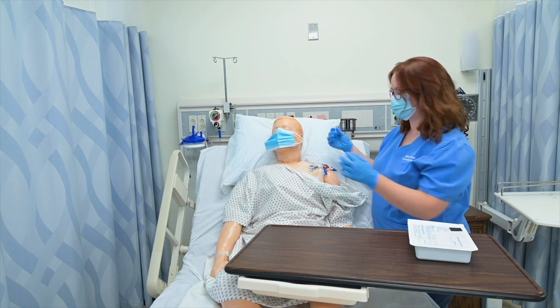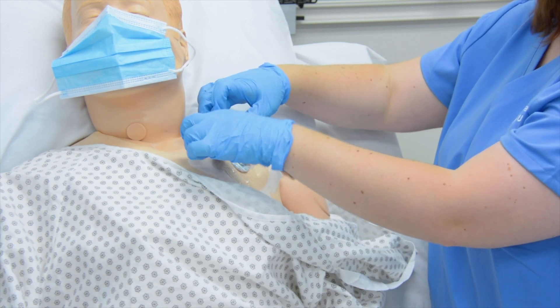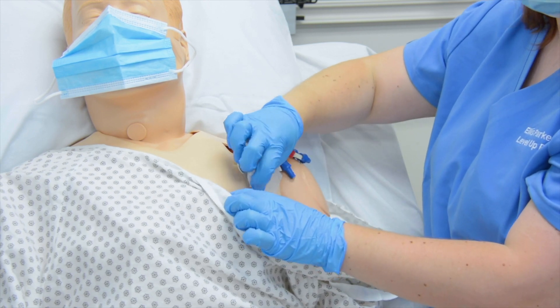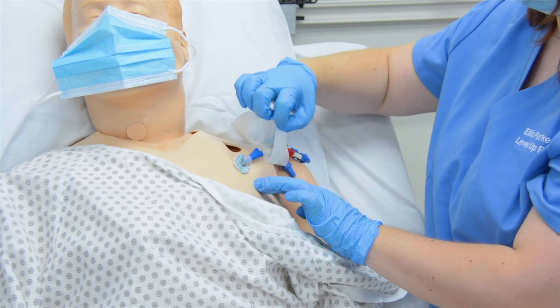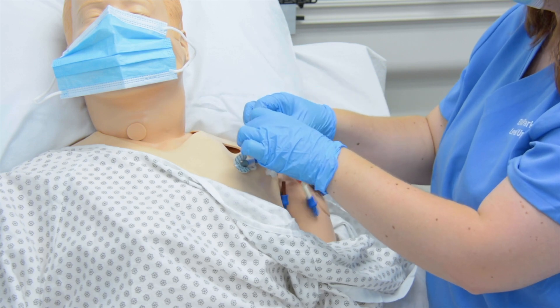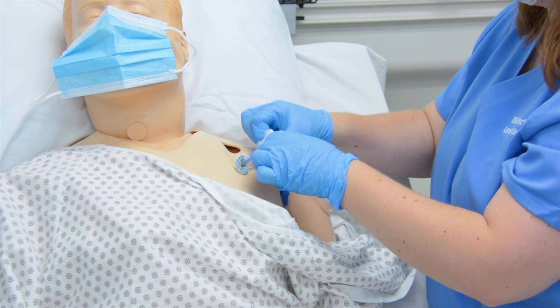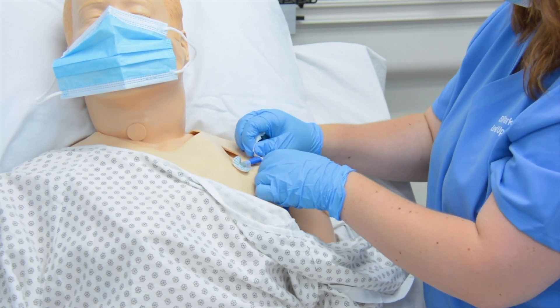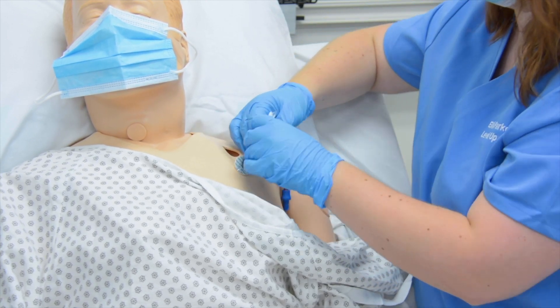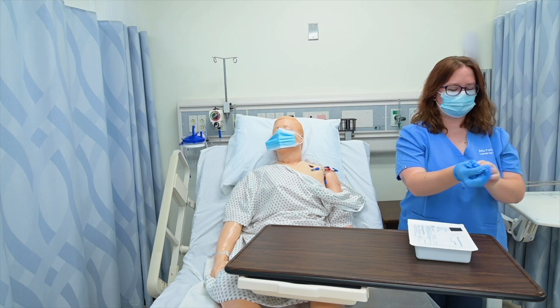My first step is simply to remove the old dressing. Without pulling on the insertion site itself — because I don't want to do any damage to the insertion site — I'm going to remove this old dressing. It's awfully sticky. Unfortunately, I think it melted just a little bit to my mannequin, but we got it off. Then I'm going to remove the old bio patch and take off my clean gloves and throw them away.